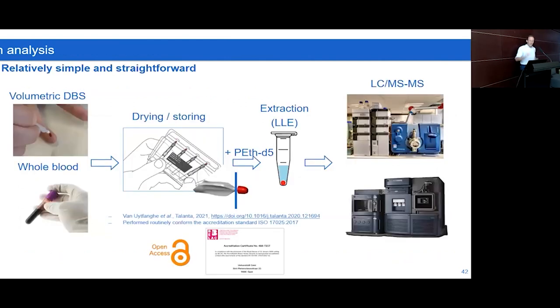Good. This is how the procedure goes. I won't go into too much detail. In a sense, for all samples, we generate dry blood spots, whether directly from the fingertip or whether we get whole blood, so we also prepare it. We demonstrated equivalence between both, and it's with an LC-MS/MS procedure after having performed a liquid-liquid extraction. There's quite some details that are really important to do it in the right way. So we now perform that under full accreditation.